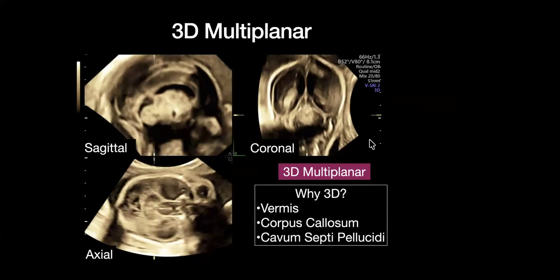How many of you like to use multiplanar imaging? That's one of my favorites. And it's so, so helpful. I feel it's underutilized, but it's something I feel like many of you have to learn. And in order to learn, you have to keep doing it, right?